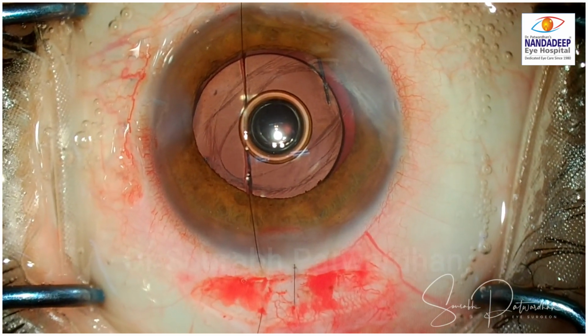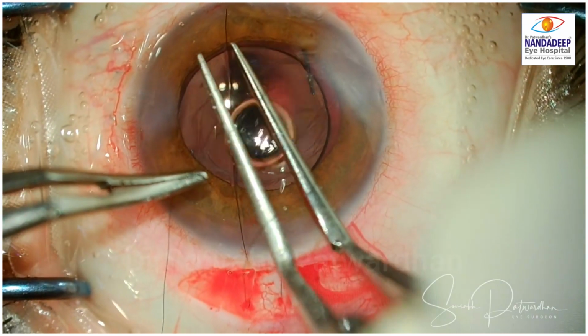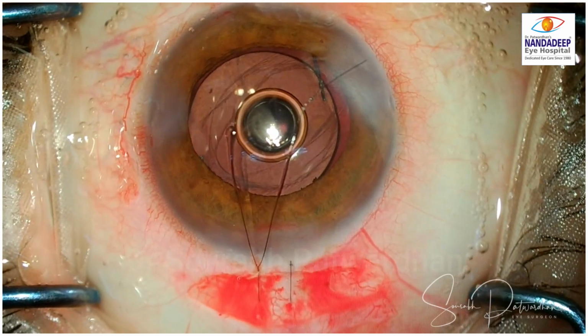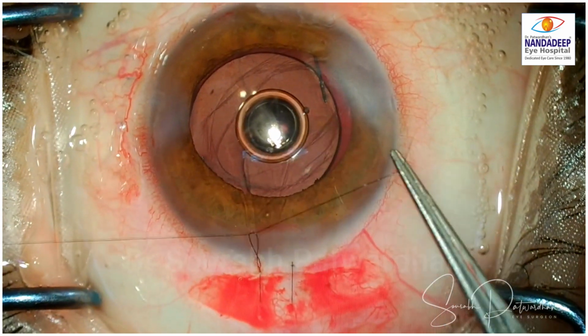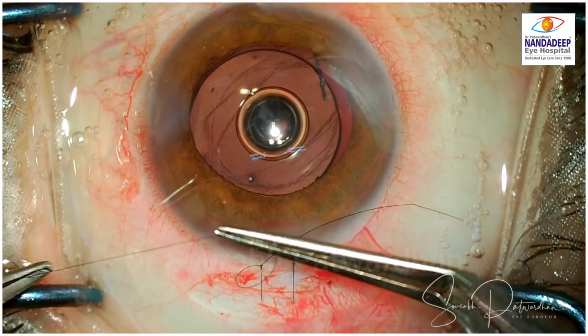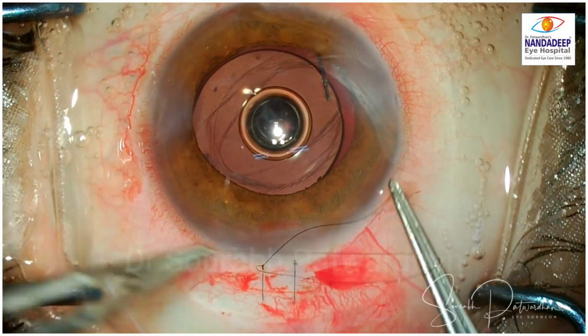The wound is sutured with not so tight sutures, just to avoid any gap, as this is a partially vitrectomized eye, so we don't want any AC collapse in the post-operative period. These sutures are buried into the sclera and the wound is closed.